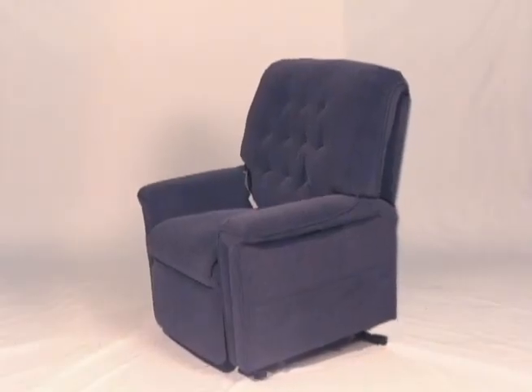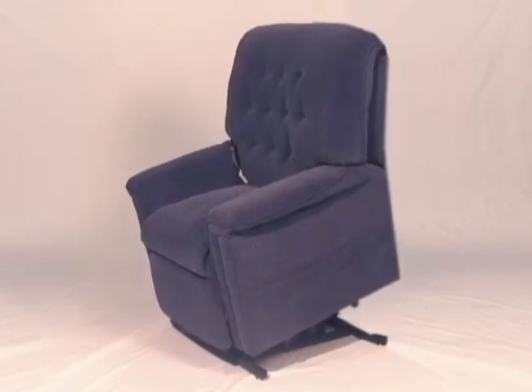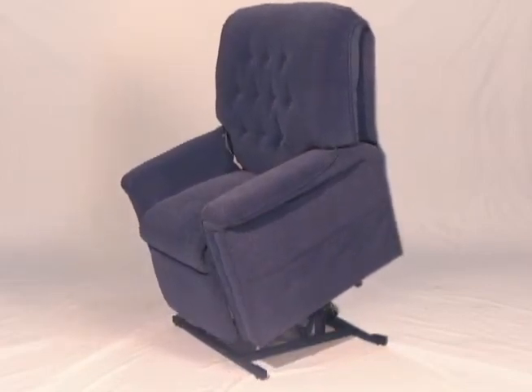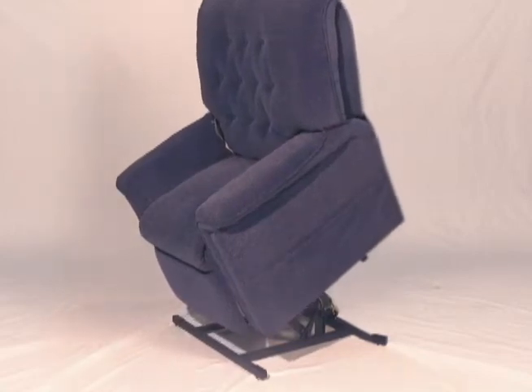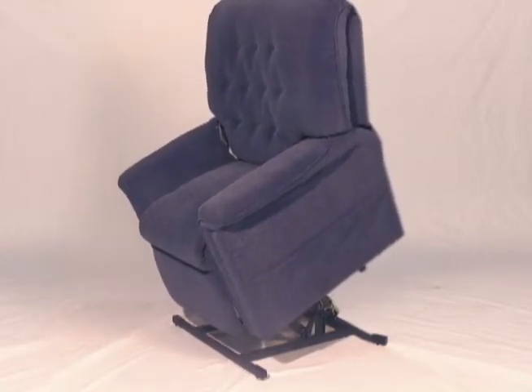The Pride 358 lift chair is a three-position lift chair that smoothly adjusts from a vertical lift position to a full reclining position. As you can see, a three-position chair safely and comfortably lifts you into a standing position.